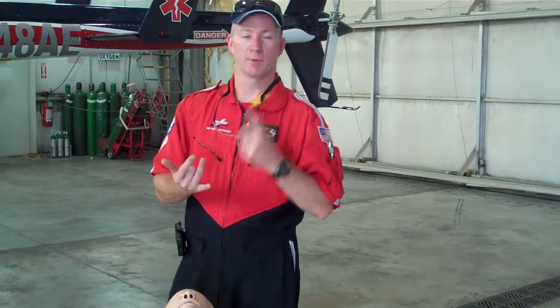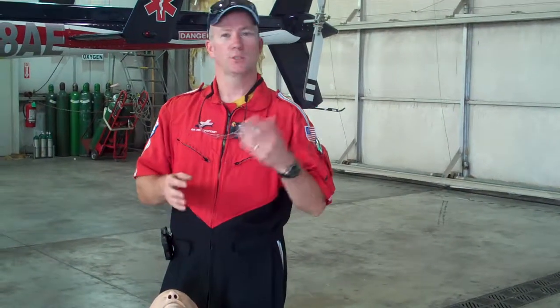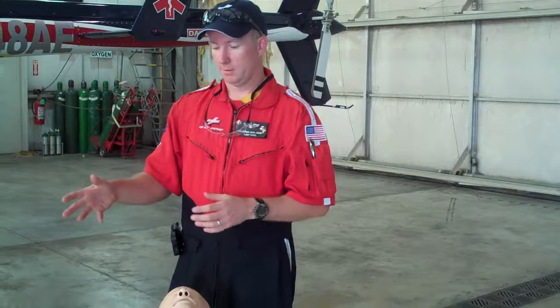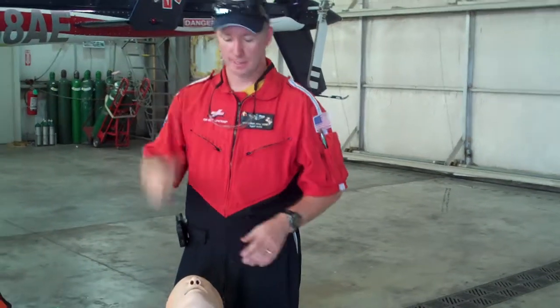We can either do an emergency cric or a tracheostomy. Doctors typically do that percutaneously at the bedside. It's a much more controlled environment, many more hands on deck to assist in that surgical procedure. I'm going to demonstrate a surgical cric, which are done often in the ERs and often in the streets in trauma situations.